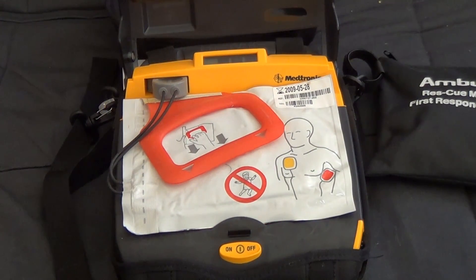Call for help now. Remove all clothing from patient's chest.